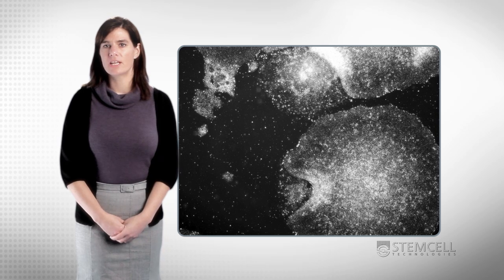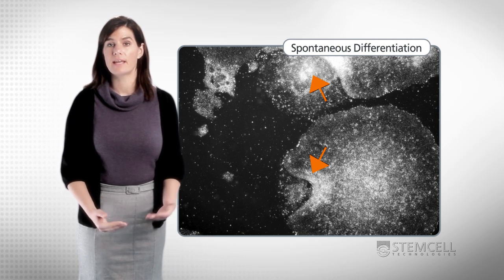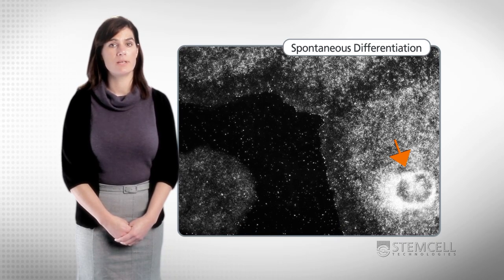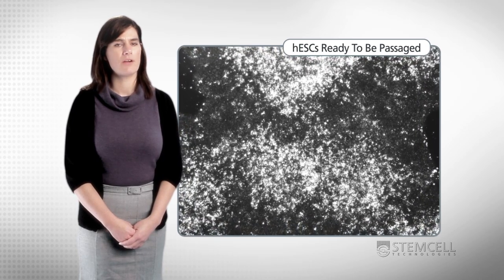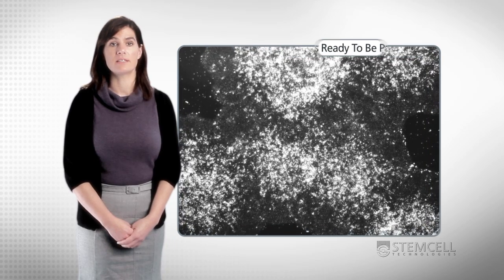Some spontaneous differentiation in a culture is expected — it indicates that the cells are healthy and still able to differentiate. Areas of differentiation are characterized by the presence of morphologically different cell types within or at the edge of the colony. Good quality cultures plated at the appropriate density and passaged correctly should display only a few areas of differentiation. You may scrape away these areas before passaging the cells.